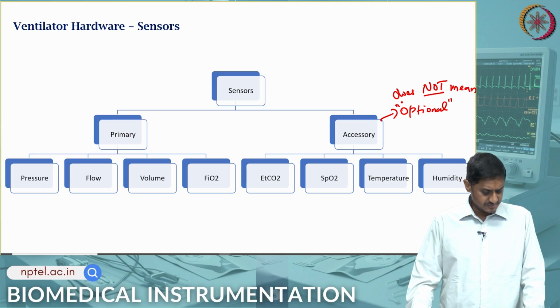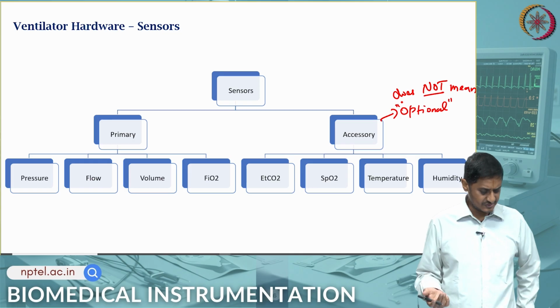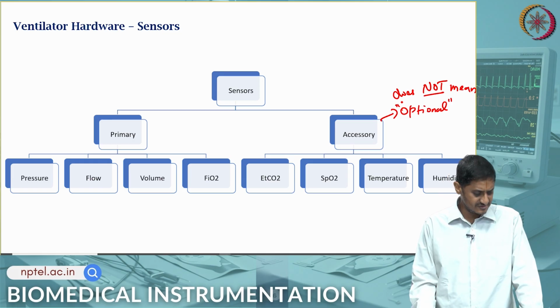By the way, if you have many sensors, it does not mean it is a better system. Your sensors should provide actionable information, otherwise there is no point in having many sensors. Also, sometimes students think that digital sensors are better and do not require calibration. Digital sensors also require time to time recalibration, something to keep in mind.